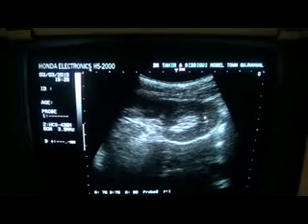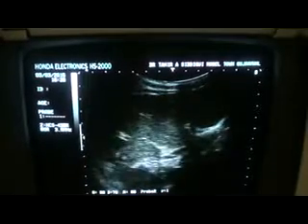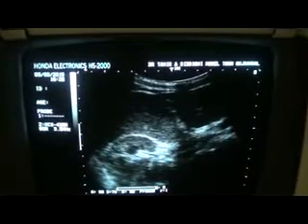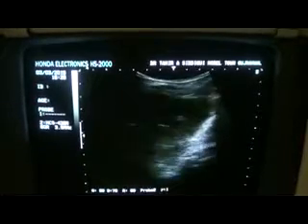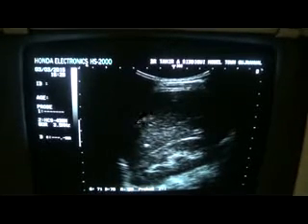You can see the pyramids and the central sinus echo complex. This is a very common mistake that can be made if you don't know this pitfall. When we say the echogenicity of the kidney should be equal to or less than adjacent liver parenchyma, we must first make sure the liver is normal. Then you can apply the rule. Otherwise, scan from a different angle — better to go through the prone position.